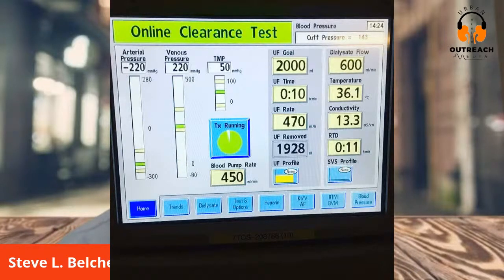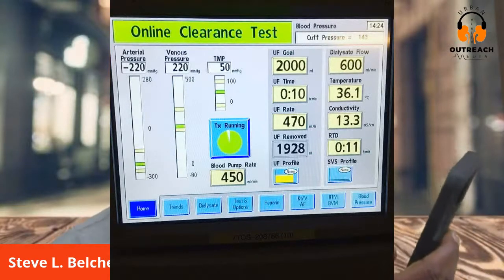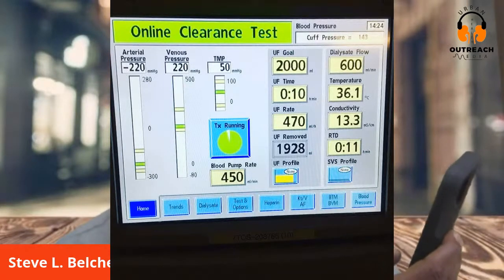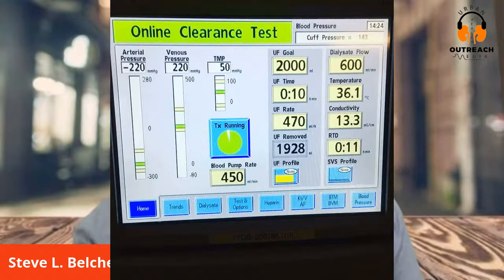And when you come down below the temperature, the conductivity measures the solution in the dialysis. The conductivity is the solution, the electrolytes that are in the bath, and it has to be at a certain level for it to work with the dialysis. The right mixture has to be properly mixed. And when you come down where it says 11, that's how much time the person got. The SVS is the sodium profile that the person is on.